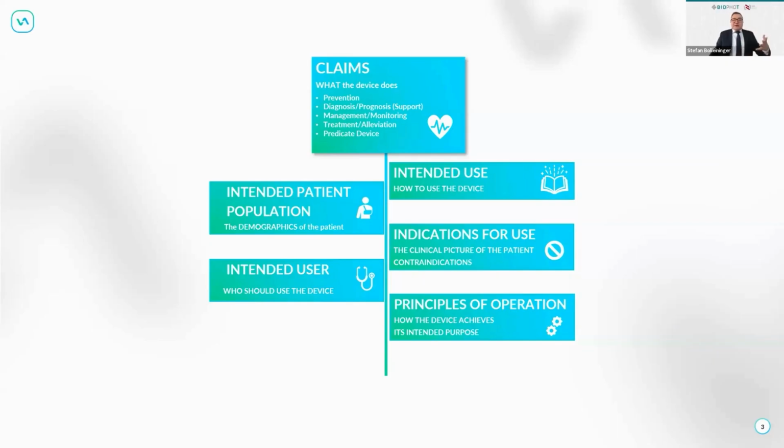Thinking in particular now about things like ChatGPT, Copilot, whatever, OpenClaw, DeepSeek, you can use whatever you want, every AI works in the same principle. It utilizes a lot of data to get an outcome. But does that always constitute a medical device? And there's the question now for the manufacturer: what kind of claim does it include?